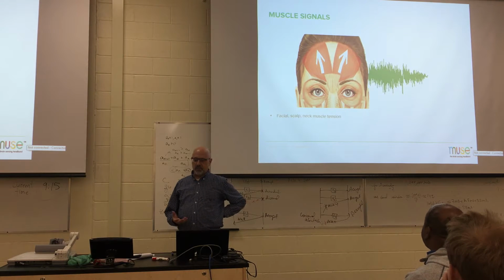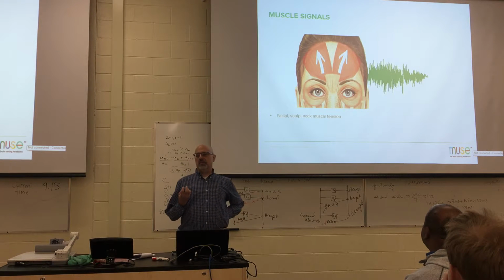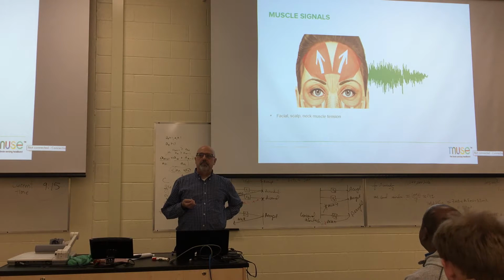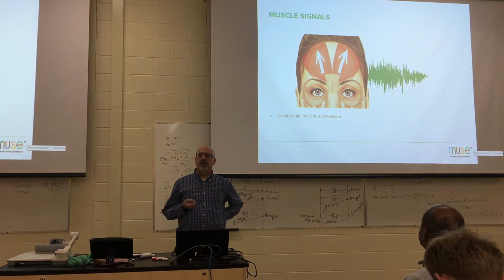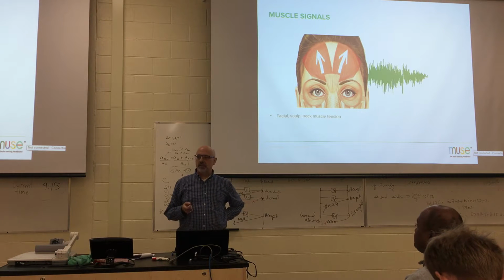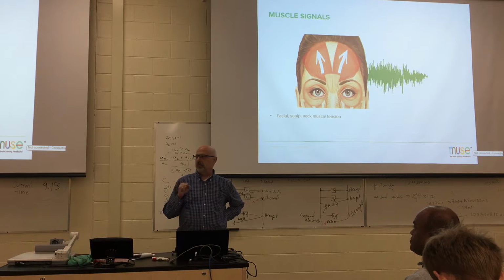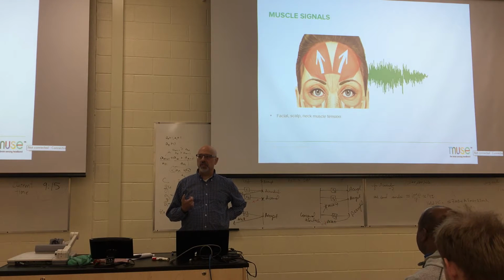The muscle fiber is similar to a neuron in that it'll propagate an action potential in the same way. So muscles will create a lot of electricity, from very subtle, small voltages to, like a jaw clench, which will produce a very strong muscle signal, and it's a very high frequency signal.